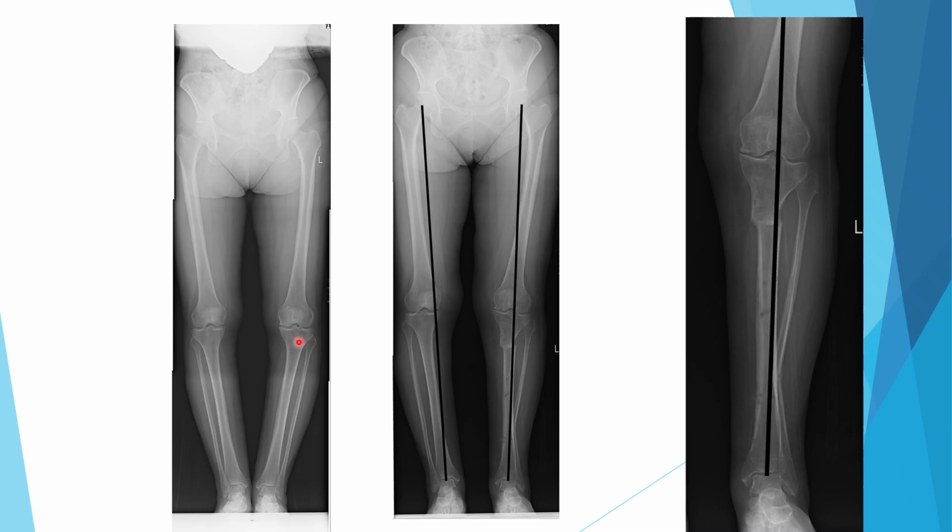So here is our patient. You have the varus here. And we put the frame, and we put this point here as the reference, proximal reference and distal reference, and we ended, as you see, with the straight line aligned. There is a translation, as you can see.